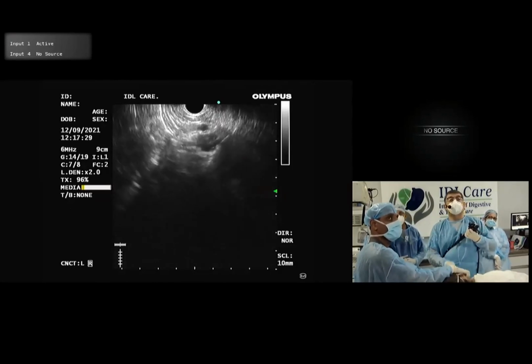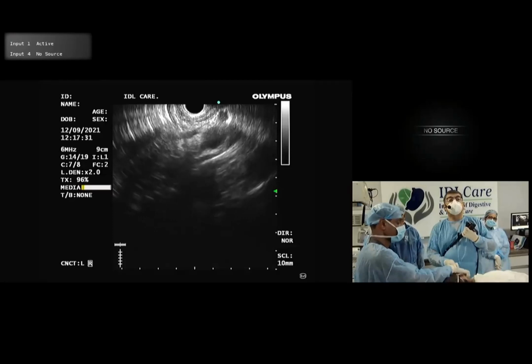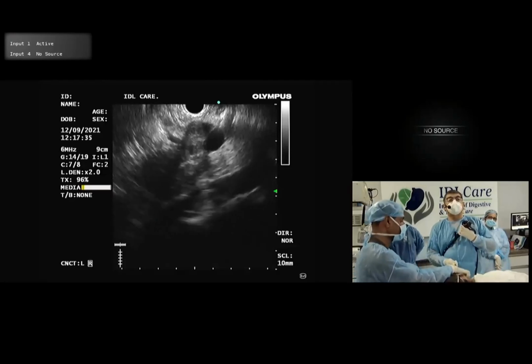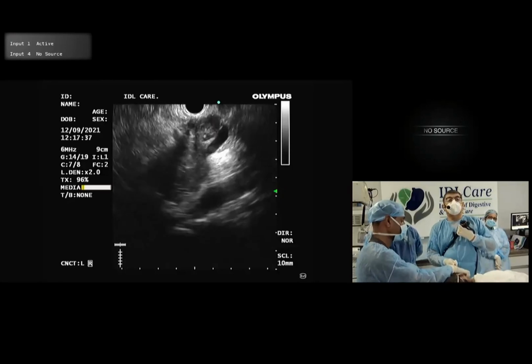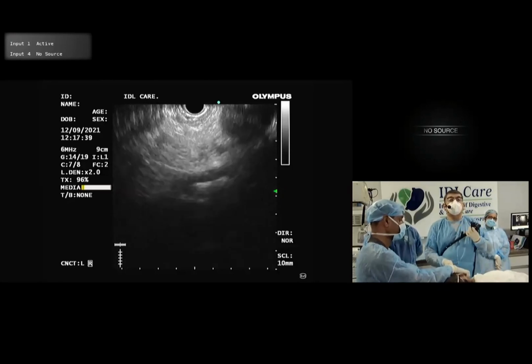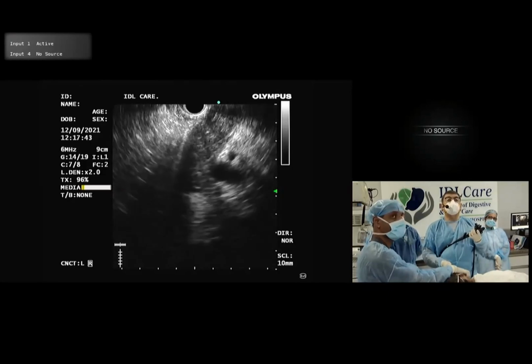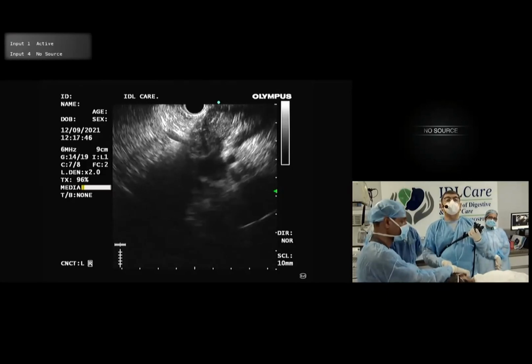See this? We go again. I'm turning clockwise. Portal vein. And then that is the splenic vein. Sorry, I fell over the spine. So the scope suddenly turns above the spine sometimes. See, that is the confluence.